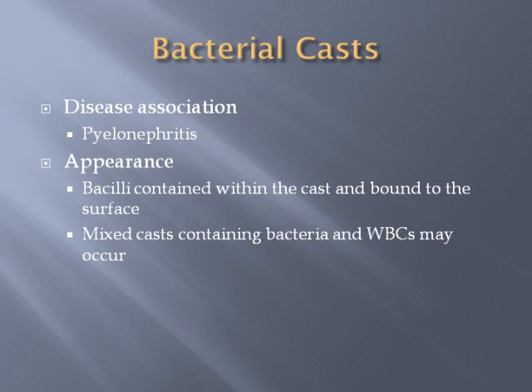I couldn't really see images of this. I don't think that these are very common. As far as us seeing them, they may be there, but I'm going to guess that most people are just going to call these a finely granular cast and not be able to differentiate and see exactly what's in there to call it a bacterial cast.